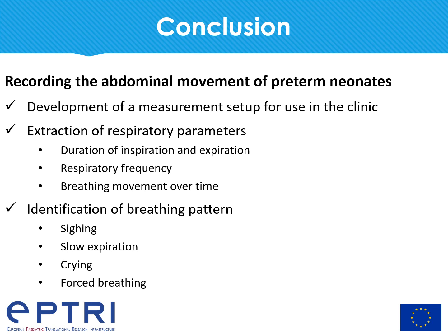As a next step, we will implement these findings into an abdominal movement model based on actuated pin matrices. By controlling each pin independently, changes in abdominal movement can be simulated exactly. That's it for my presentation on the recording of abdominal movements of preterm neonates using a time-of-flight camera.